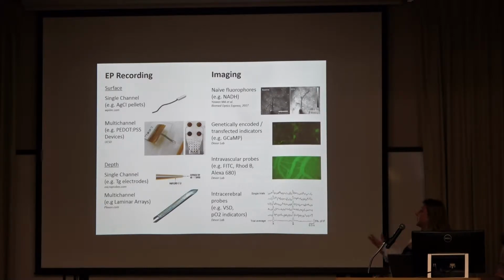When we look at recording and imaging, I just wanted to summarize that there are different types of electrodes which can be used for measurements from the surface or depth. They can be multi-channel or single-channel electrodes. And today we are going to talk about this.